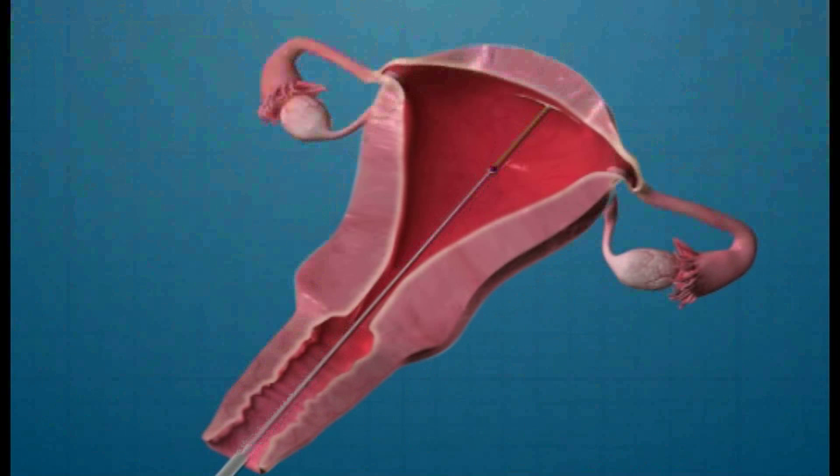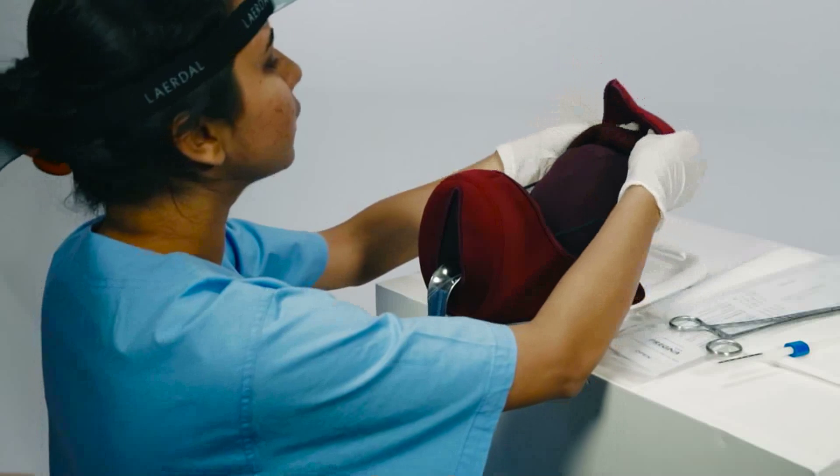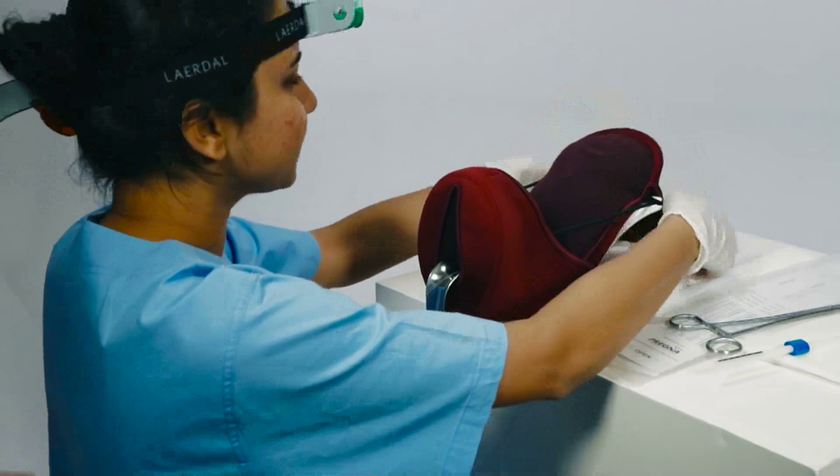Cut the strings right at or just inside of the cervical os.